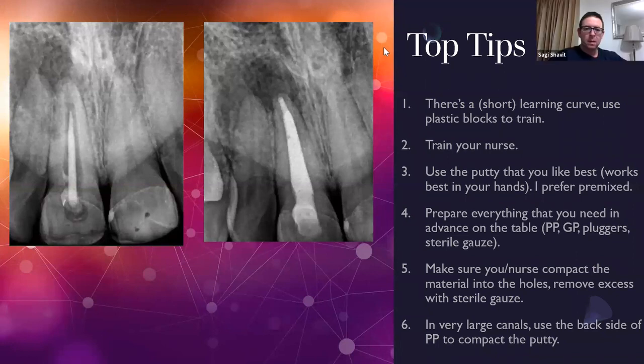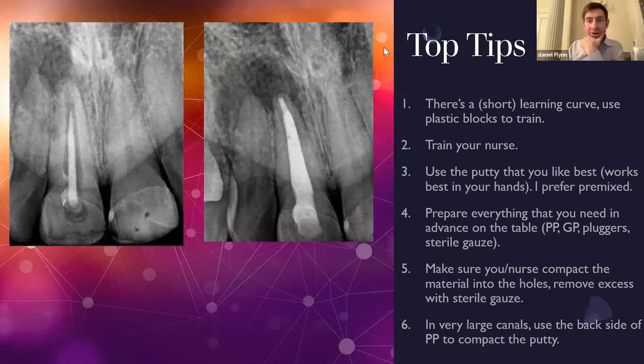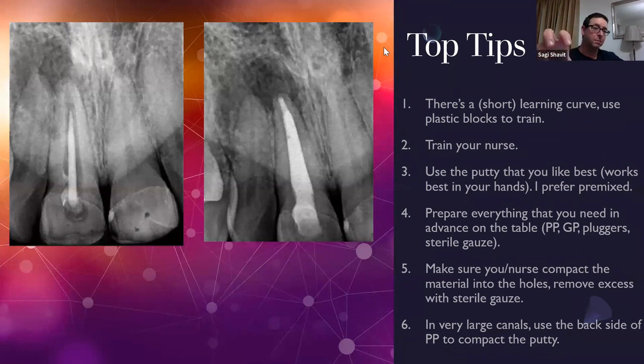Can you place 2 millimeters of putty for an apical plug in very curvy canals? Sure. In those situations, the putty will go wherever you want it to go. But if you have a curved canal from start to finish, use gutta percha. Gutta percha bends as a plugger, I mean.